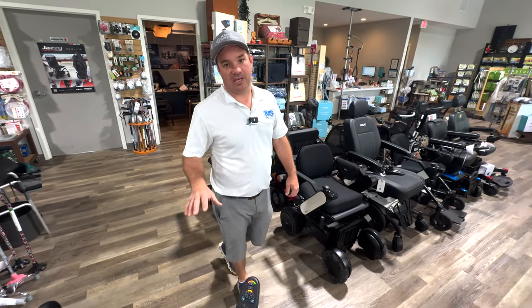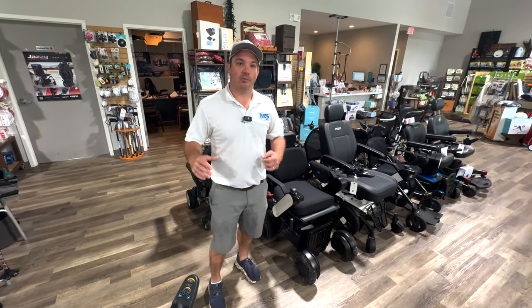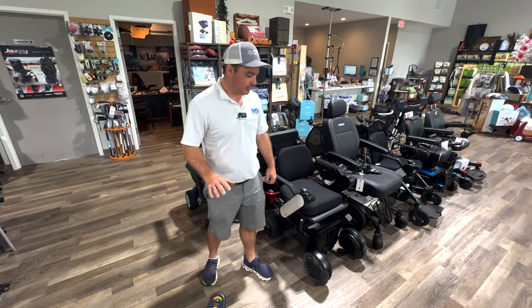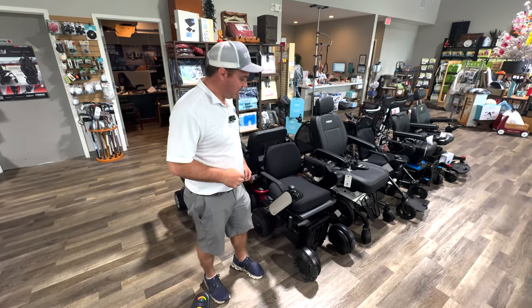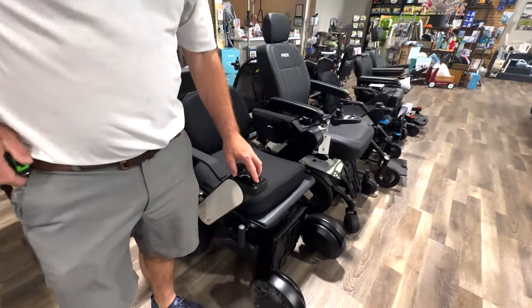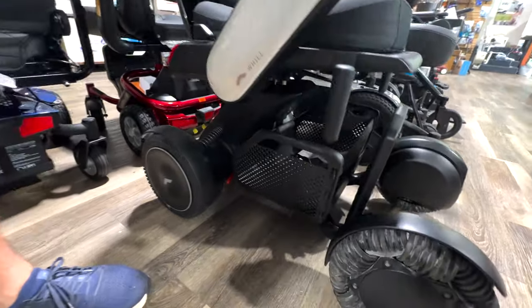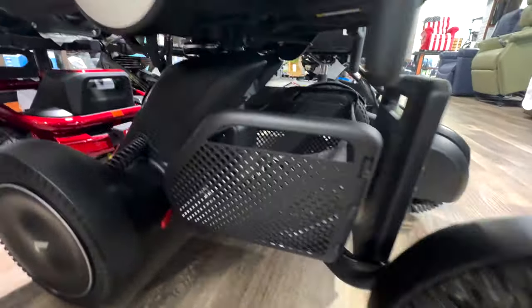We just talked about the P312 by Meritz, the douler, the benefits of it, and the downfall of having it for some people. Right beside me is the Will CI — sometimes I'll refer to it as CI2, but it's actually the CI. This is a really cool chair. It's like your Tesla power wheelchair.